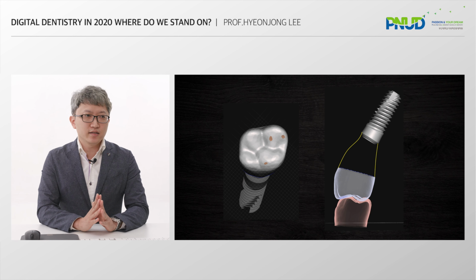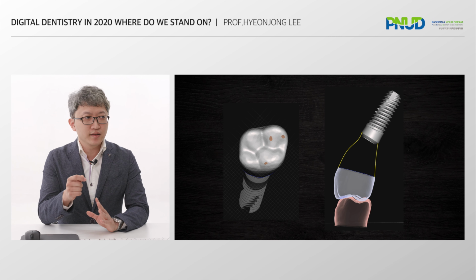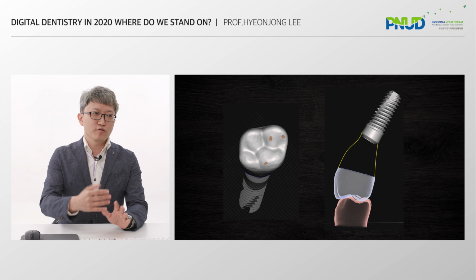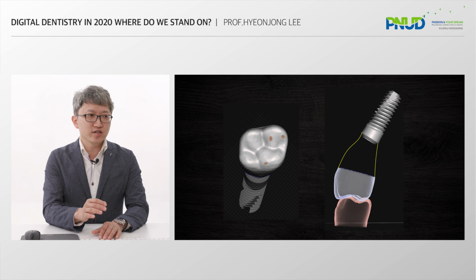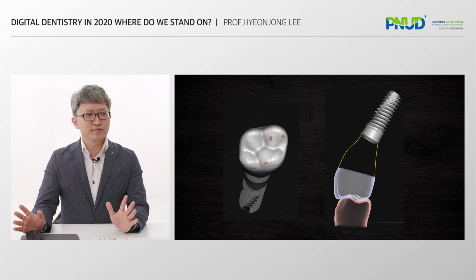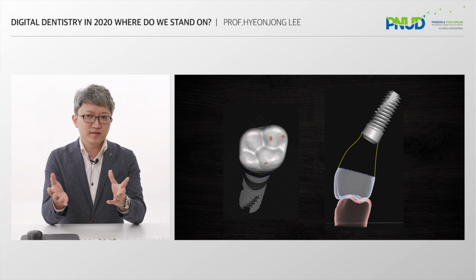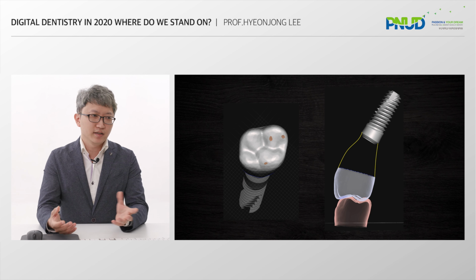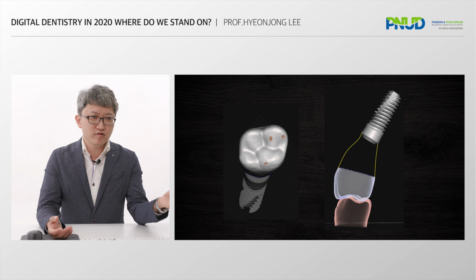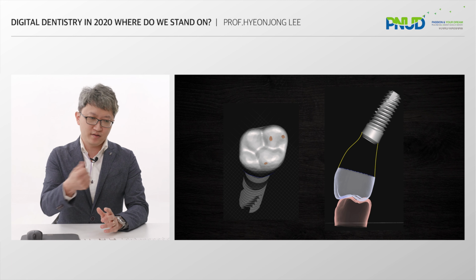The dentist rarely designs the occlusal design by themselves, or the dental technician designs the implant crown, and we don't know about the design of the crown. They design and fabricate it and send the implant crown to the clinic, and we just perform occlusal adjustment and set it.